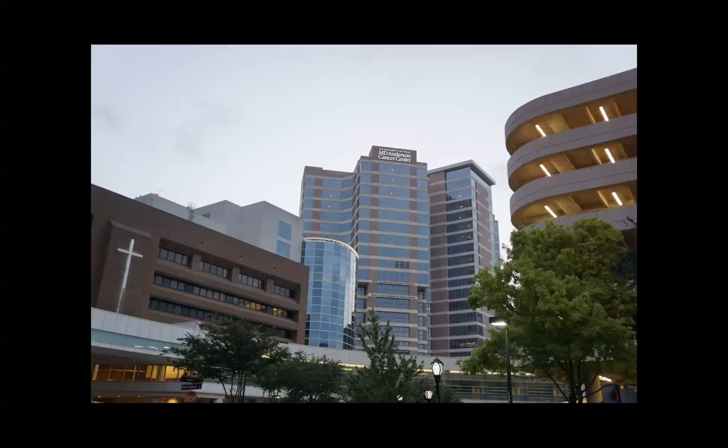And that's why I try to do a good exam with white light and take time to examine. One of the problems that I face with chromo is that the moment I put on the dye, the endoscope light is cut off. For some reason it gets darker, and the pools of puddle are again harder to see. So how do you normally do your chromo?